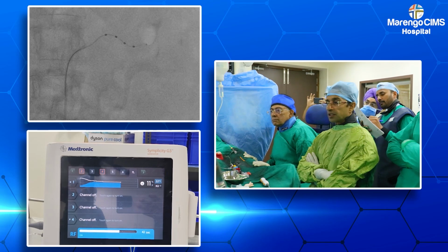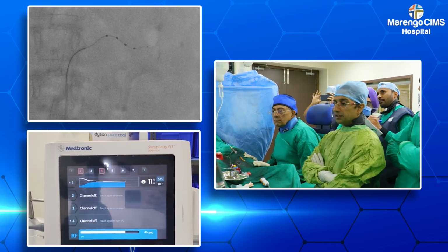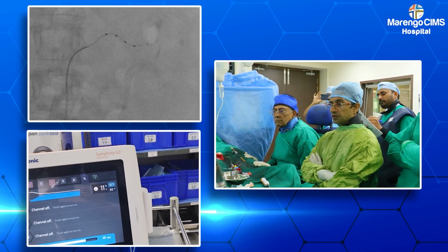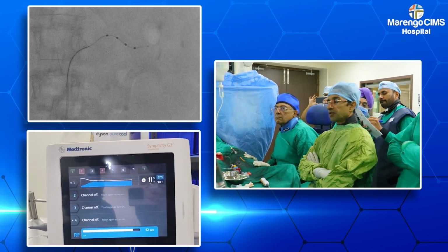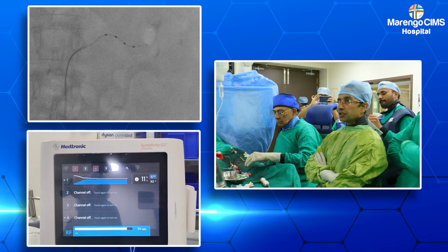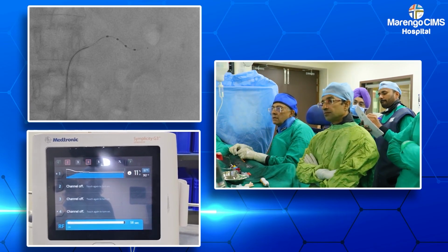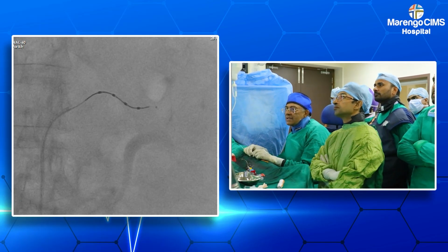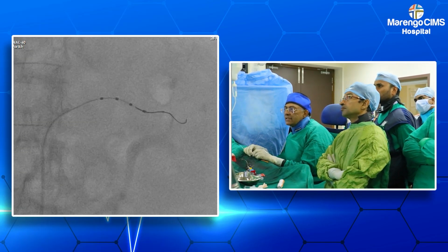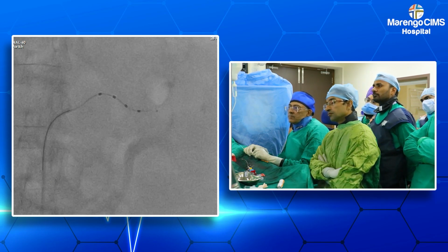The pressures presently are about 170/90. We started off with about 220 by 100. So there is some immediate fall in the blood pressures, but we would assess once the procedure is done. Proximal segment of the inferior middle branch of the three branches.